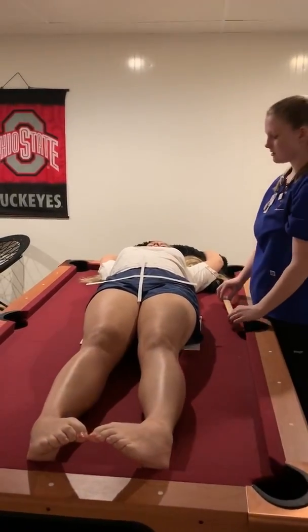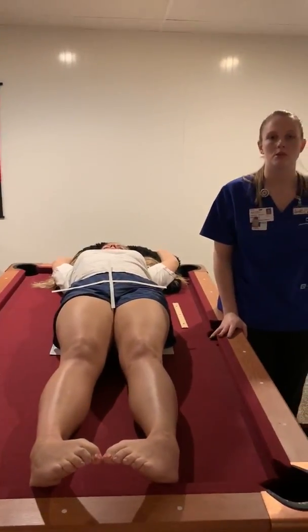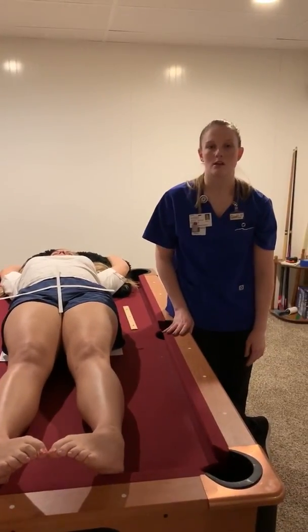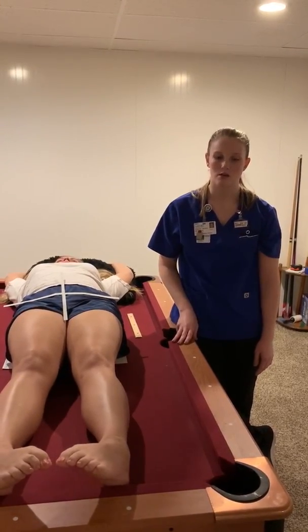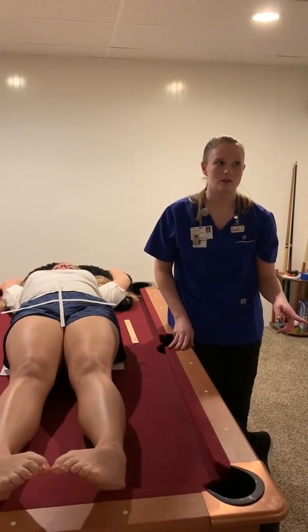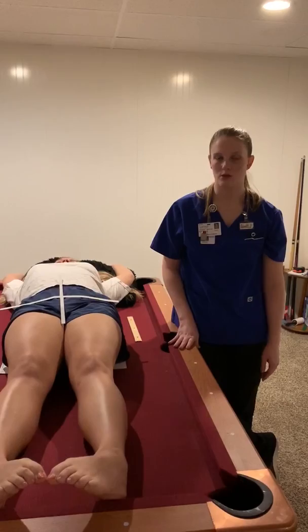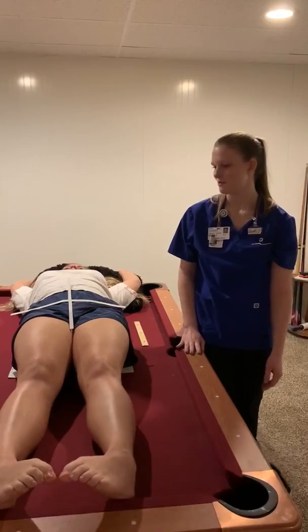So it'd be about 23 centimeters. Then I would go outside the room and shut the door and look in the lookup chart underneath the pelvis and the bucky and look for the 23 centimeters to get the kVp and mAs that I would need. I would put those into the control panel and then select the table bucky and the small focal spot. Then I would tell the patient to take a deep breath in and hold it, and then hit the exposure, and then tell the patient they can breathe.